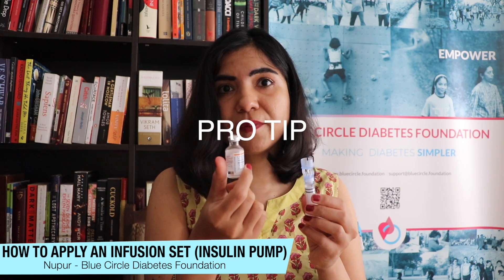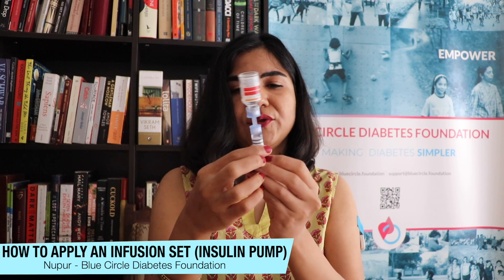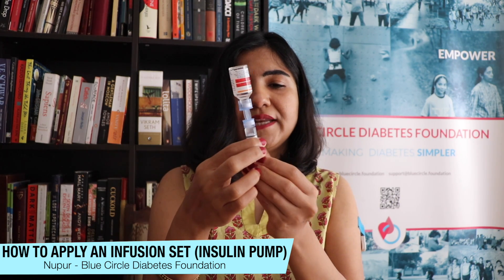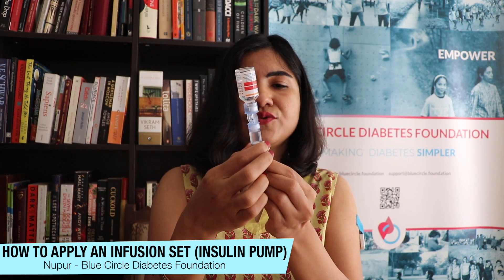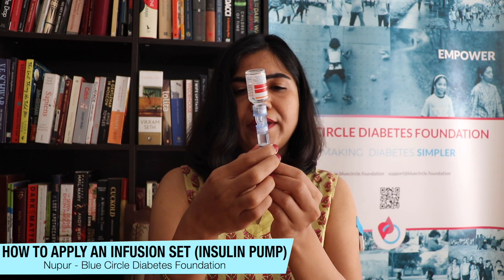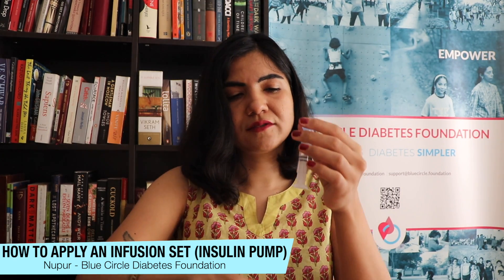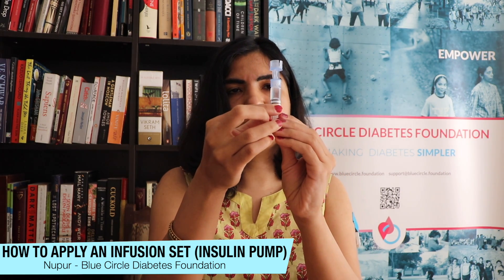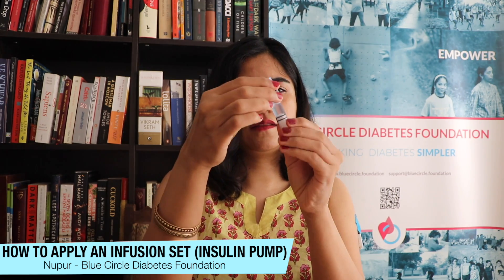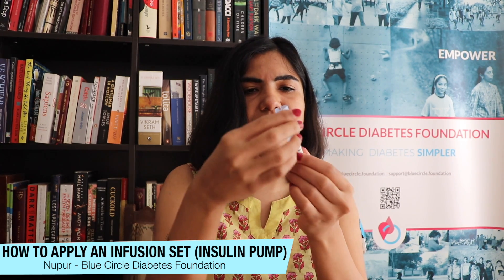I use a vial because it's cheaper. I fix the reservoir in here and draw the insulin I'll need for about three days, plus a little bit more to cover any additional requirements — you could be unwell, or have eaten a big meal and need more insulin. Make sure you don't have any bubbles: take the top off to have a quick look, turn it around, and it looks like I'm good to go.